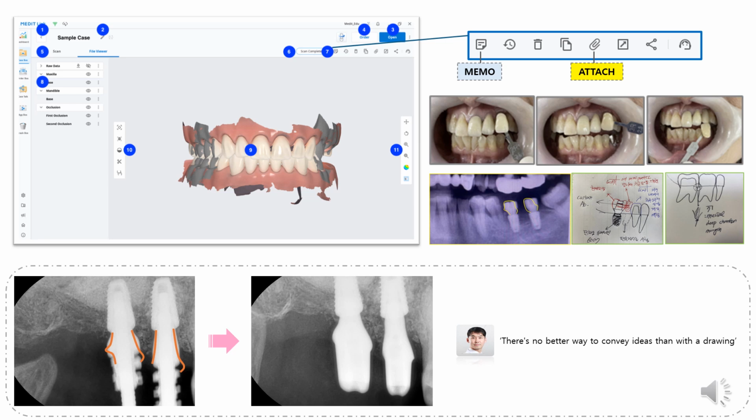At that time, we would print and attach periapical X-rays with copings to all custom-made cases, draw the envisioned shape of the custom abutment on them with a marker pen, and send them to the lab. Although this method was cumbersome, it was undeniably effective. We continue to believe that a picture is superior to conveying information compared to dozens of characters of text. Therefore, we still prefer to send various detailed information as attachments.